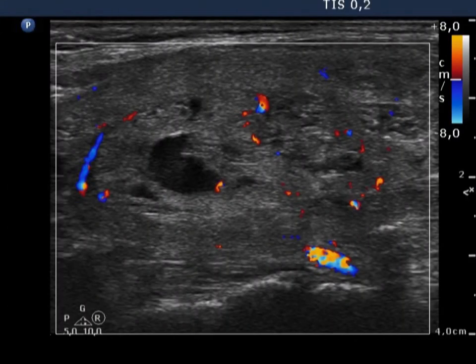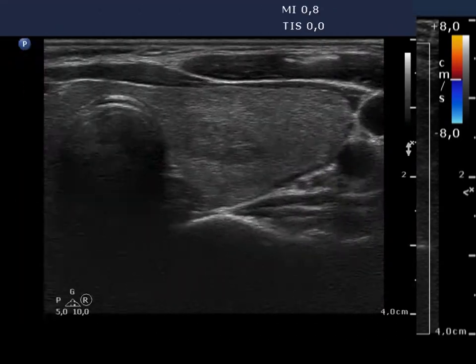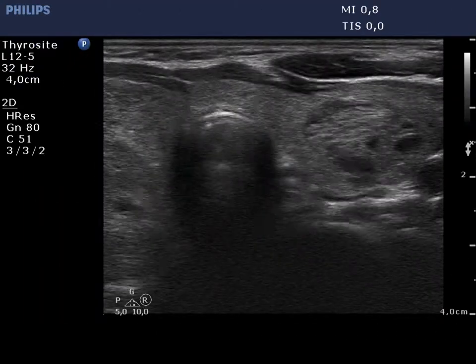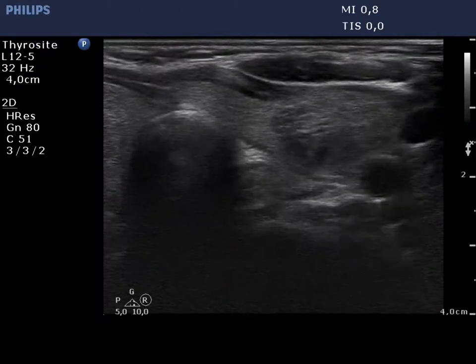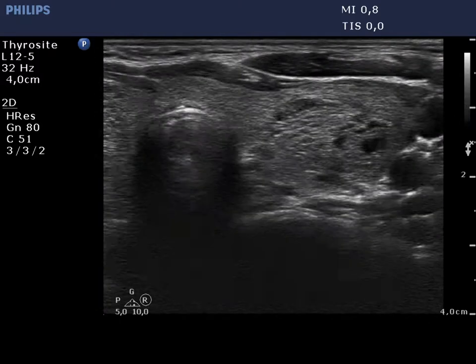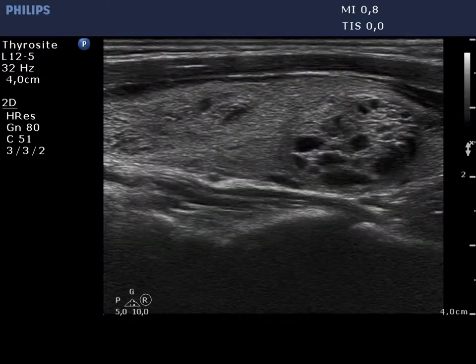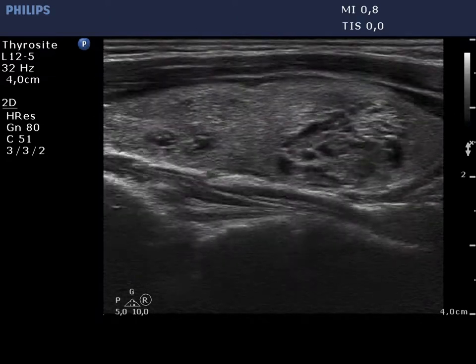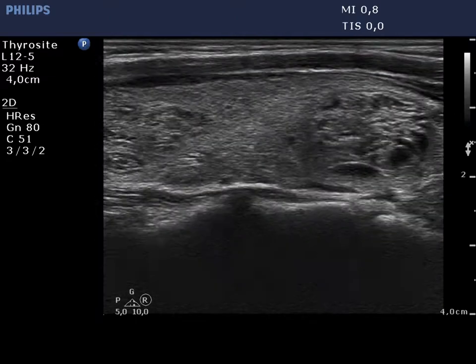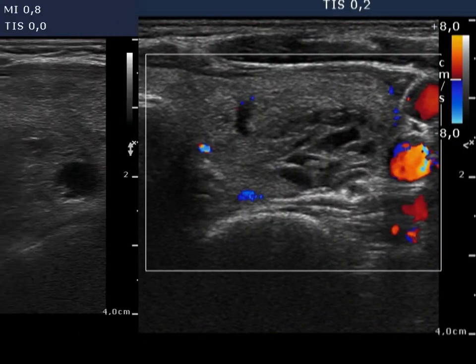Non-specific vascularization can be seen. The left lobe contains multiple nodules with cystic degeneration. The vascularization is not specific.